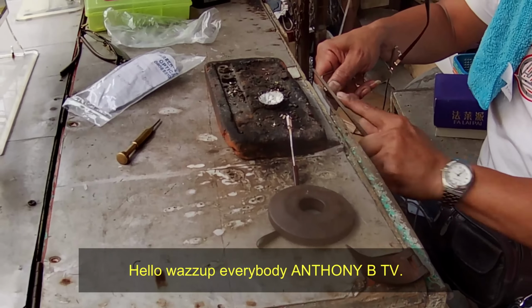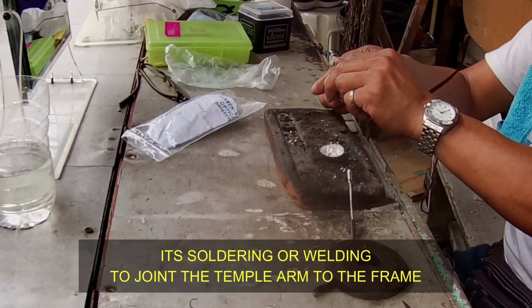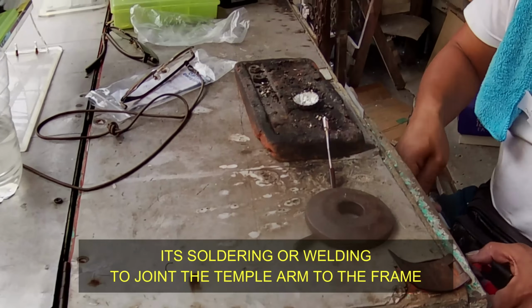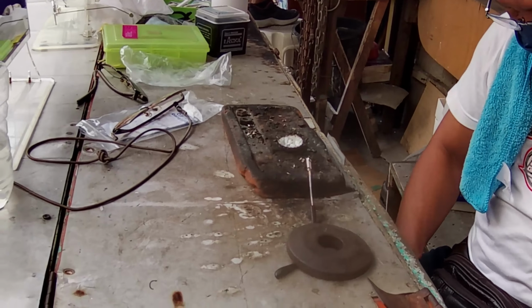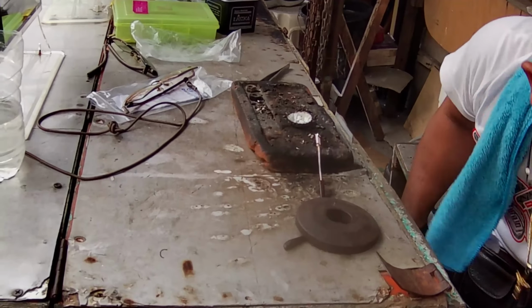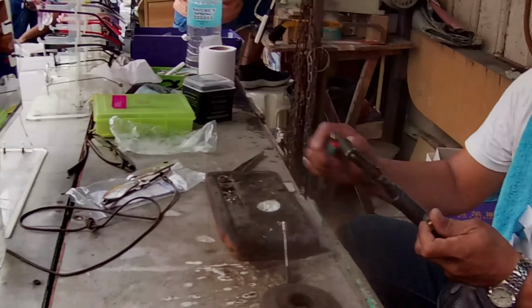So, the video for today is how to repair your broken frame. So we're now with one of our friends who made the soldering. Yeah, so now he's trying to get the lead that he will use to join the broken arm. Let's watch the video of how he repairs the broken frame, especially the arm.